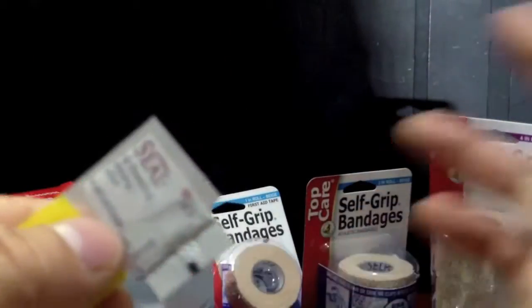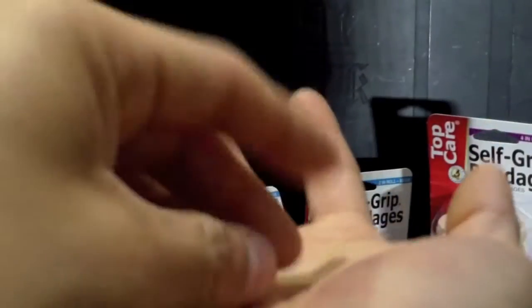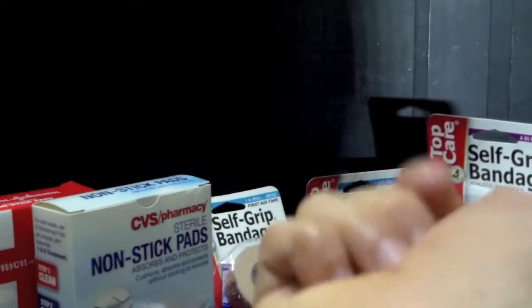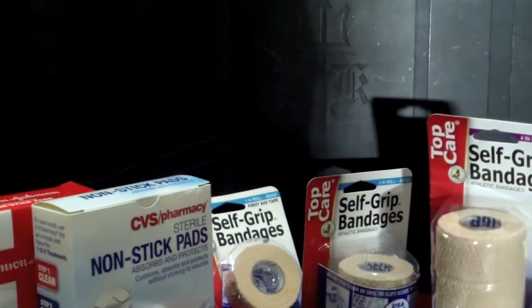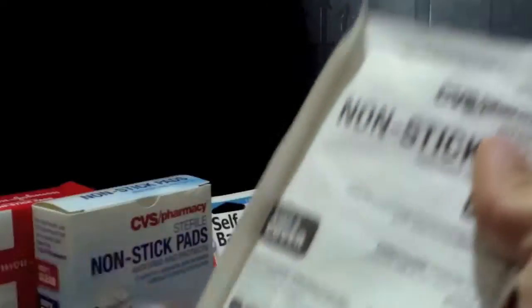The issue here is that if you pour it directly into a wound, a lot of it's hard to control. So there's a couple of techniques. One might be to pour it into your hand, then dab the small wound, for example, a cut on your finger, onto that, and that'll do it. If you have a nosebleed, you could dab your finger and then stick it up your nose. Or you could even take a piece of tissue, sprinkle a little bit of the wound seal on the tissue, and plug your nose. That'll get it to stop. It also works to take this non-stick pad, put some wound seal on it, and then cover your wound. Obviously, the technique would be, rather than putting it on the wound and then pouring all the wound seal off, to pour it onto this non-stick pad, then put the wound over.